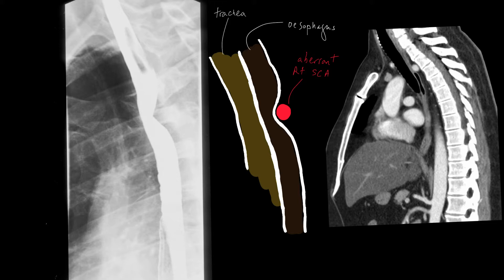You can see that this matches the sagittal CT in a patient who has an aberrant right subclavian artery. Here's the esophagus. Here's the trachea. And here's the aberrant right subclavian artery which goes posterior to the esophagus.